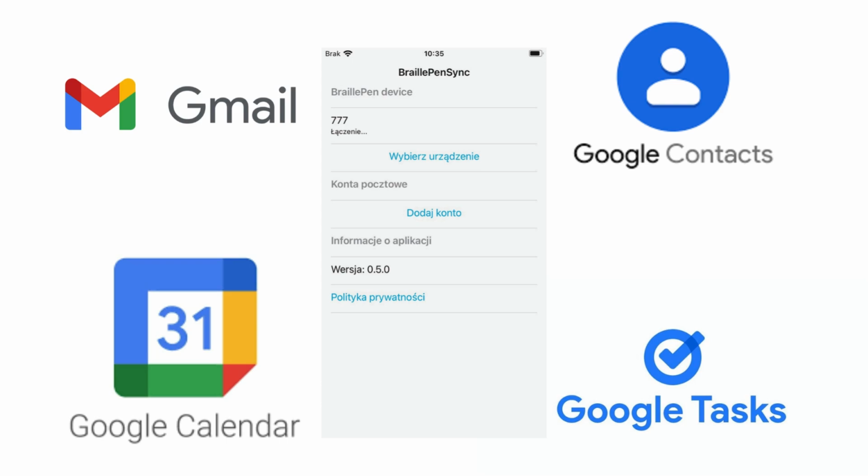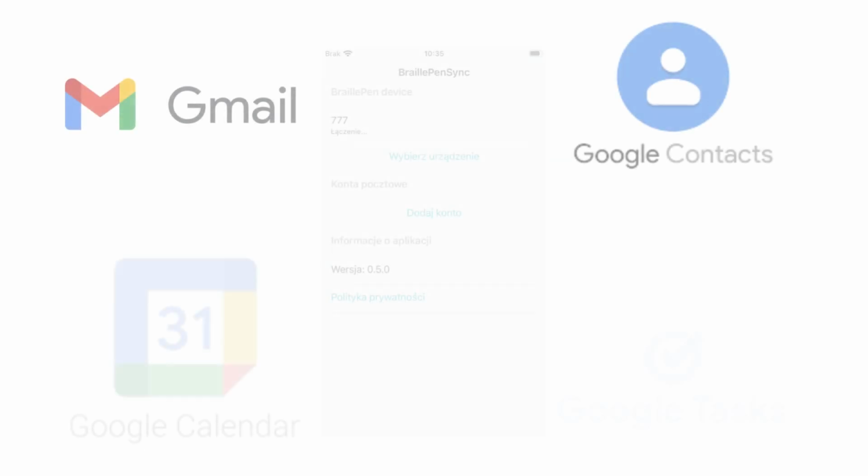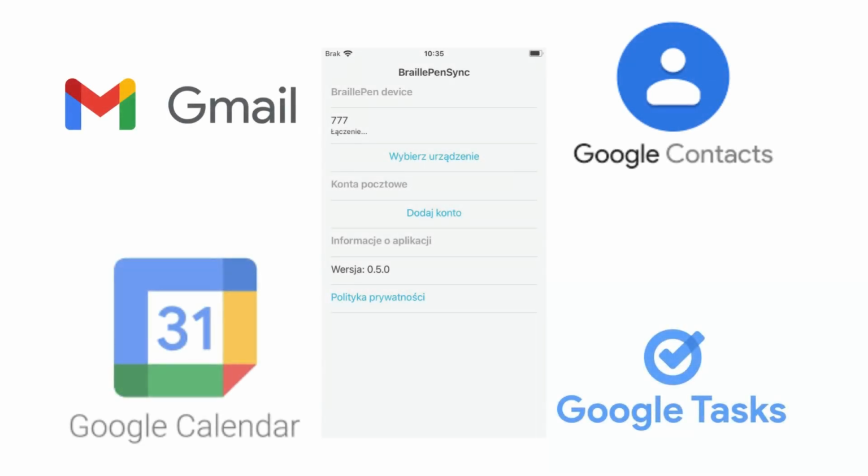and tasks, including browsing tasks lists, creating new ones and deleting existing ones, browsing lists of tasks from specific tasks list, creating new tasks and updating or deleting existing ones and reading tasks titles, notes, statuses, due times, as well as last update and, if completed, completion times, utilizing their BraillePen24 devices.